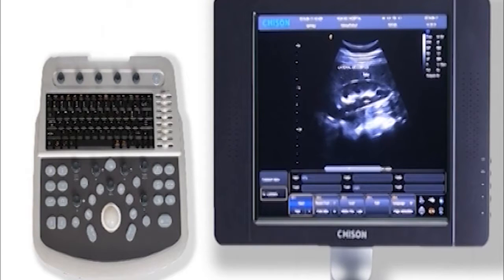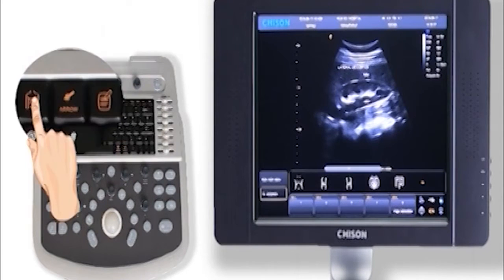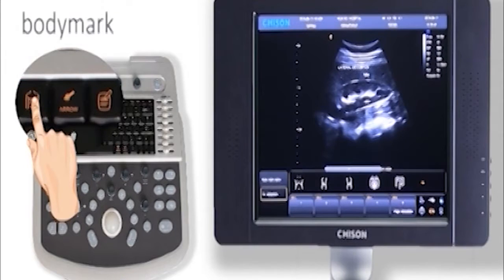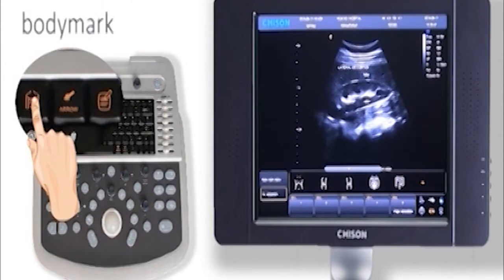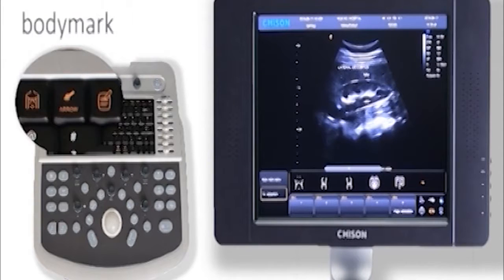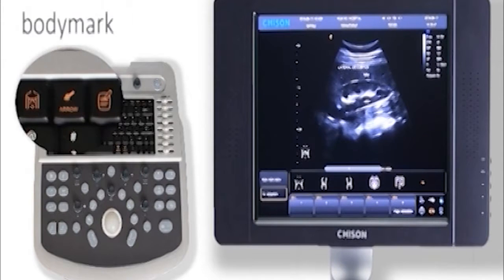Besides the comment key, there is a body mark key. Press it, all body marks of the current preset will show out. Press the corresponding knob, you can add the body mark on the image.